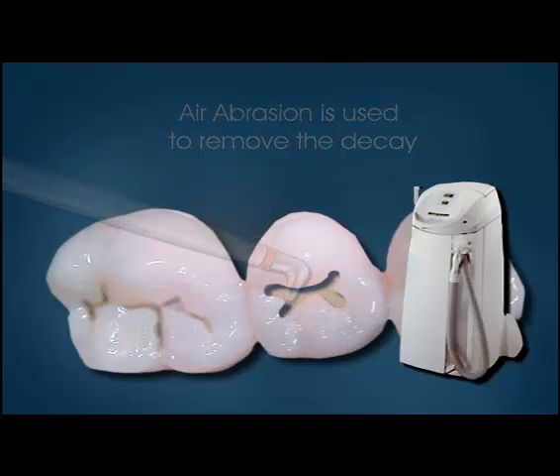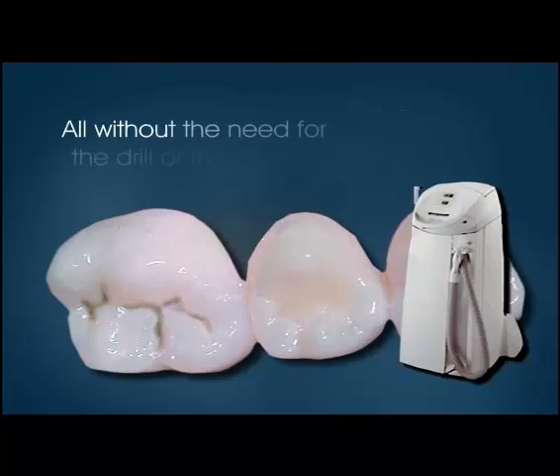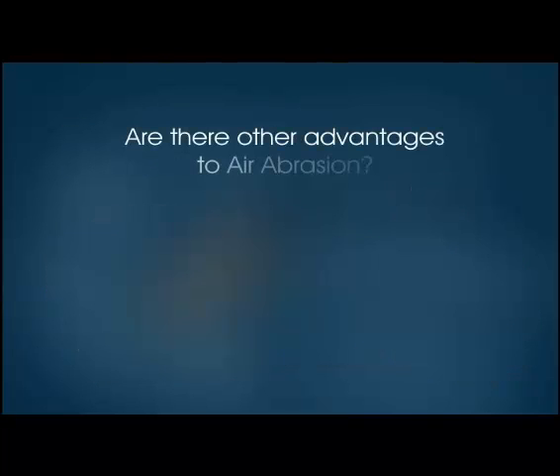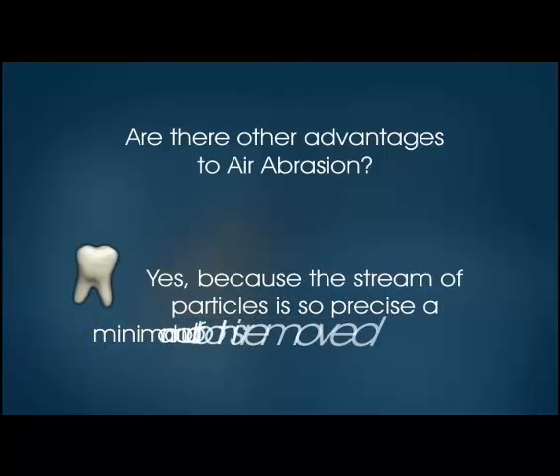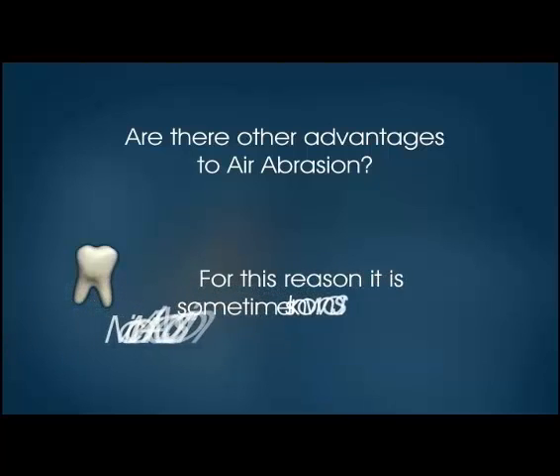A tooth-colored filling is placed, finishing the procedure — all without the need for the drill or the needle. Are there other advantages to air abrasion? Yes. Because the stream of particles is so precise, a minimal amount of tooth is removed. For this reason, it is sometimes known as micro-air abrasion.